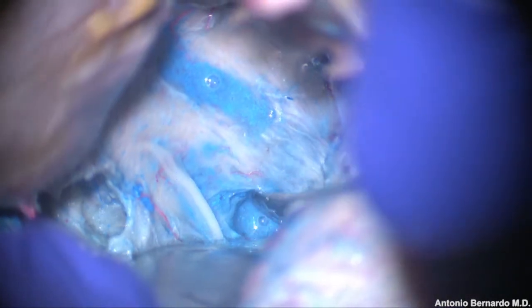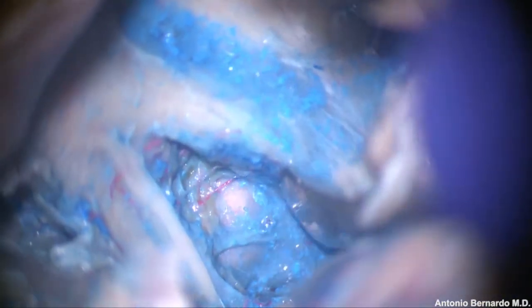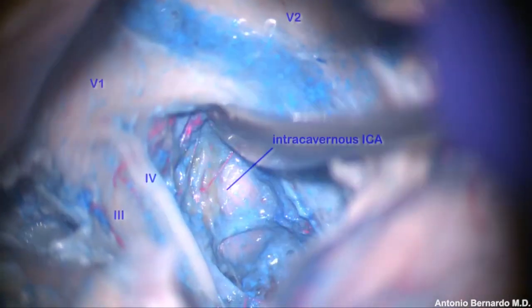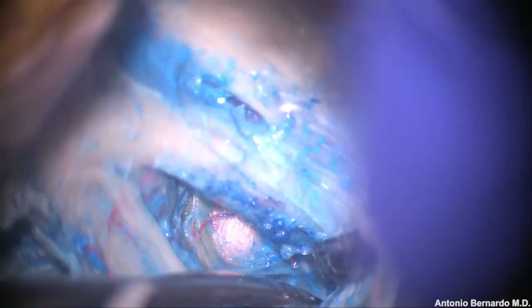The oculomotor and the trochlear nerves are visible, as well as V1, V2, and V3, the three branches of the trigeminal nerve. The Parkinson's triangle is the triangle between the trochlear nerve and V1, the first branch of the trigeminal nerve, as the main entry point extradurally to the cavernous sinus.